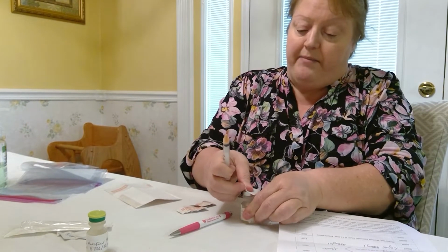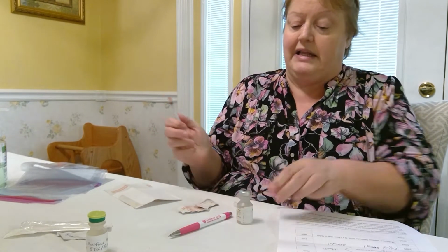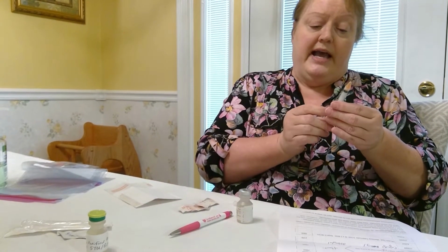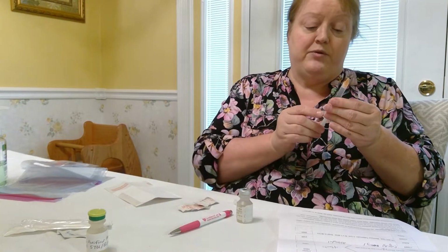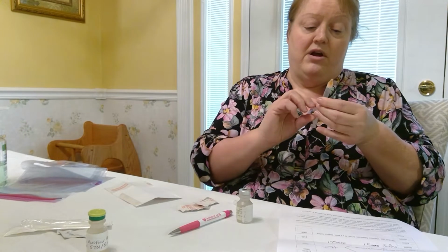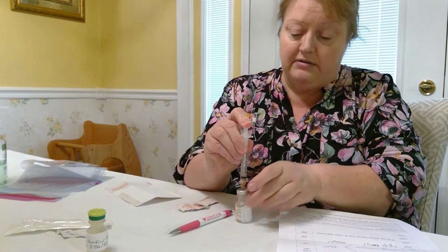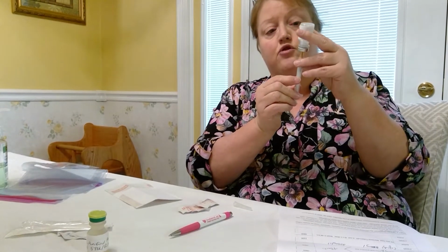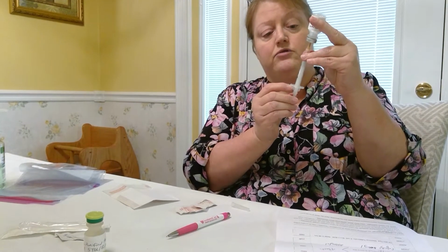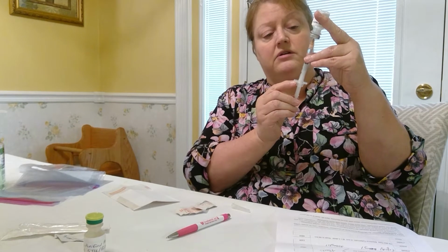Clean the top of my bottle, even if it's new and you've just popped the top off of it. Clean, allow that to dry. And remember, before you ever go into any kind of multi-use vial, you have to put in that amount of air. So I'm drawing up 2 cc's and injecting that amount into my bottle, turning it upside down, and making sure my needle is below the level of the water.